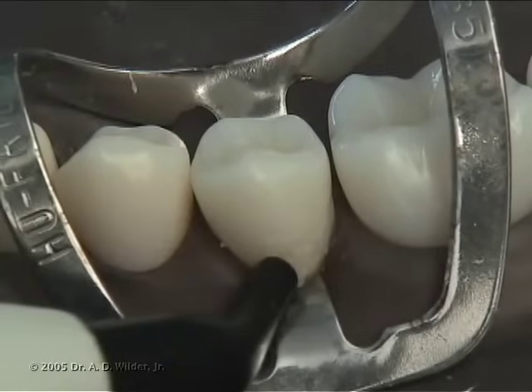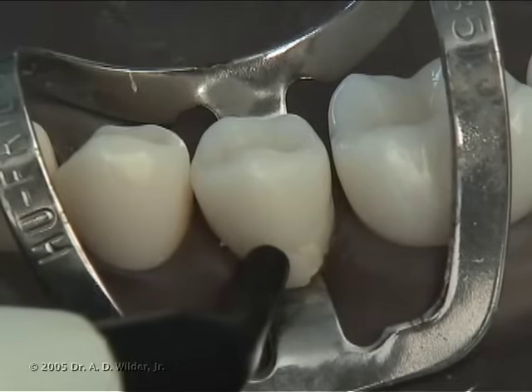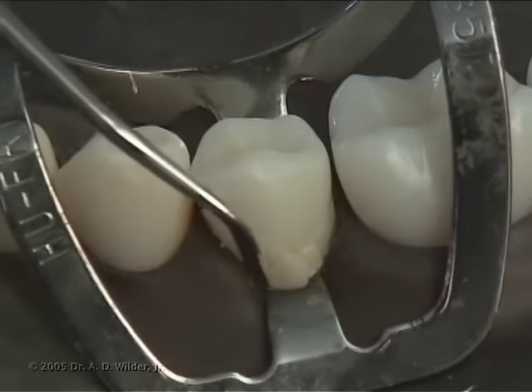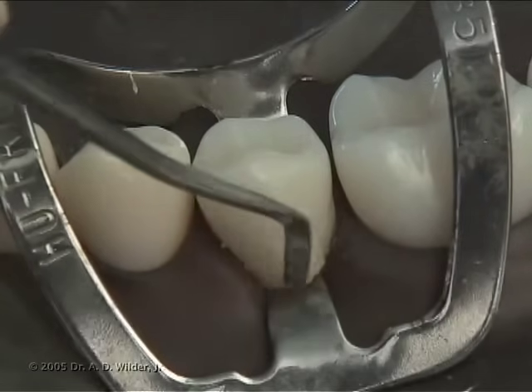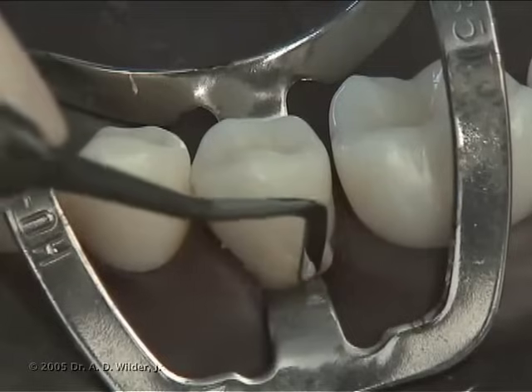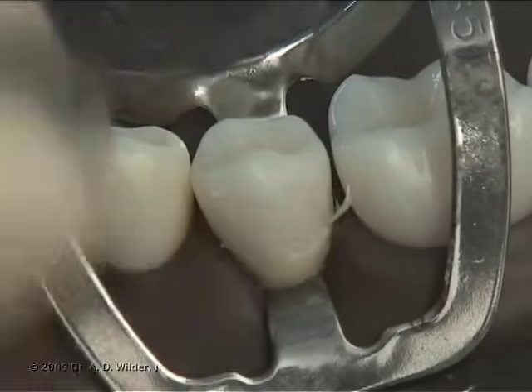Add additional composite as needed and continue to shape the material, dipping the hand instrument into some adhesive to prevent the composite from pulling off and sticking to the instrument. The closer you can get during this stage, the less contouring and finishing you'll have to do later.